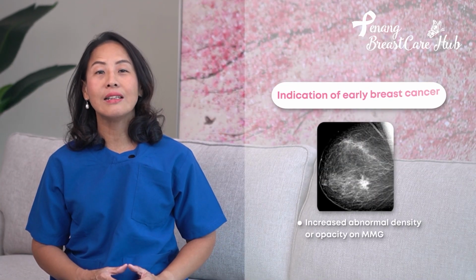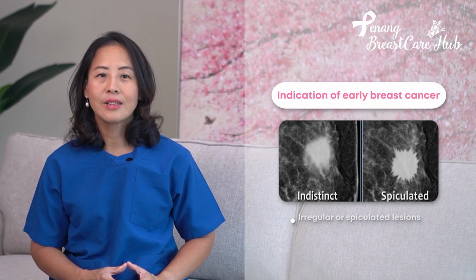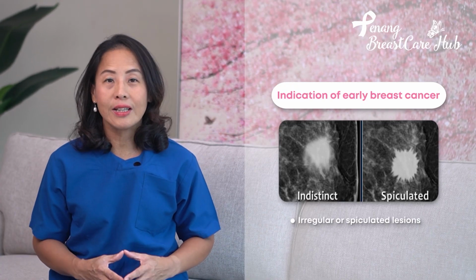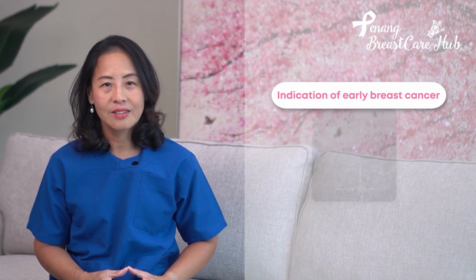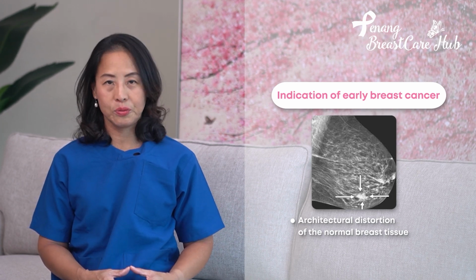Increased abnormal density or opacity seen on mammogram, irregular or spiculated lesions, architectural distortion of the normal breast tissue.